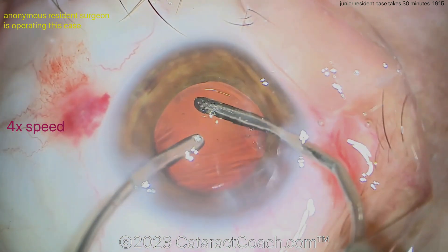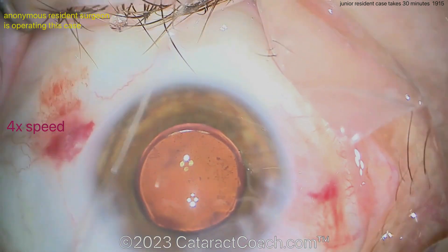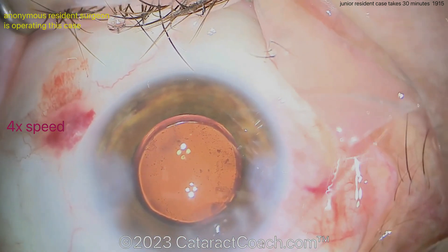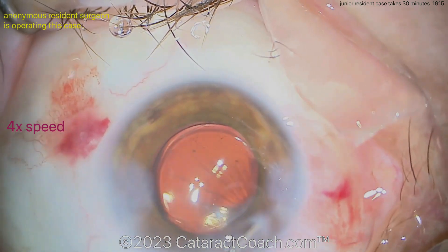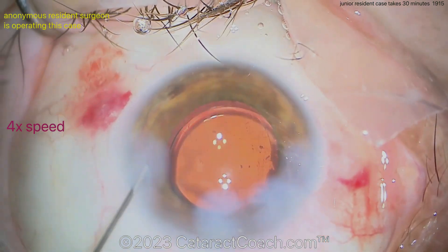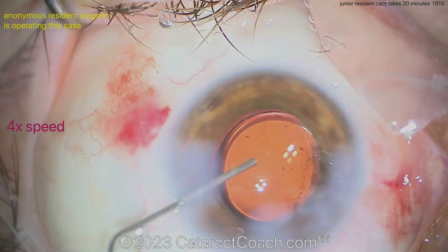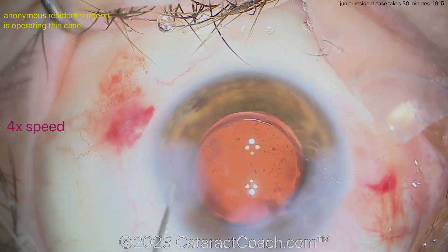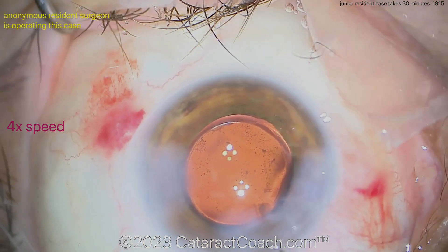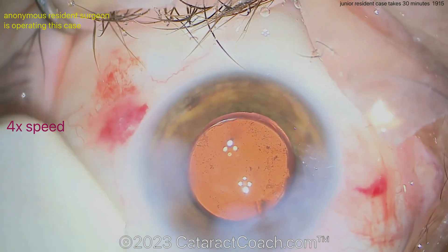You're doing a fantastic job — keep up the good work. Don't worry that this took 30 minutes — it's perfectly fine. Just stop grabbing the conjunctiva. And now — way too much hydration of the incision. Why? No — we don't need all that. If you have great construction and architecture of the incisions, they don't need such massive degrees of hydration. That's just going to cause corneal irregularities, astigmatism, and warpage. It won't be pretty on day one. It'll be fine after a week or two or three, but you need to do less hydration.